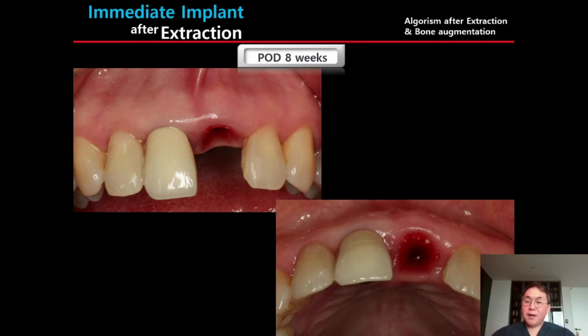But when packing the bone graft material at the soft tissue level, this bone graft material should play a role as a pillar. No need to make bone. No need to regenerate the soft tissue. The main purpose of this graft material, which was placed within the soft tissue level, is just a pillar to maintain the mechanical stability of soft tissue. That's all.